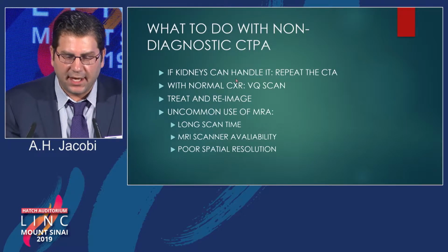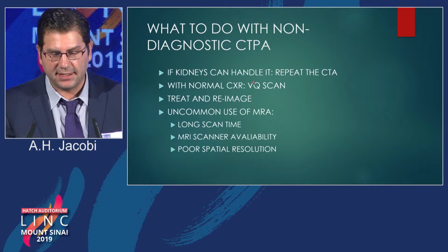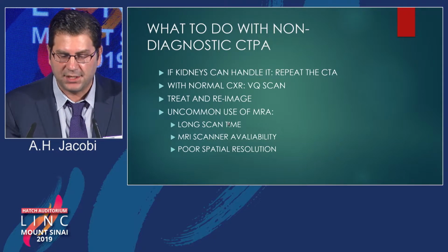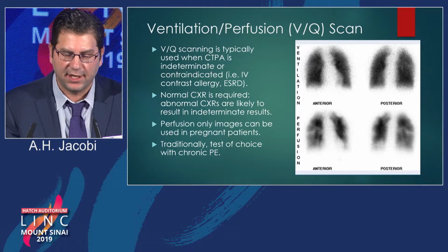So what do you do with a non-diagnostic CT? Well, if the kidneys can handle it, I just repeat the CT. You can consider a VQ scan, you can treat, reimage, and then MRI is not so commonly done. It's a long scan time. You have to have scanner availability, and the spatial resolution is not as good.